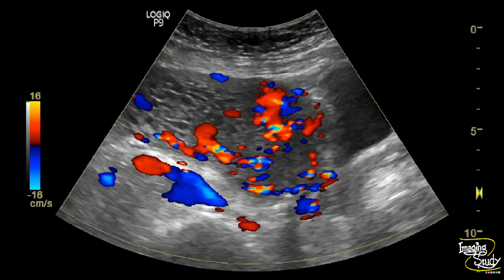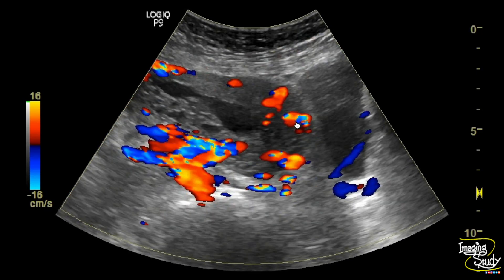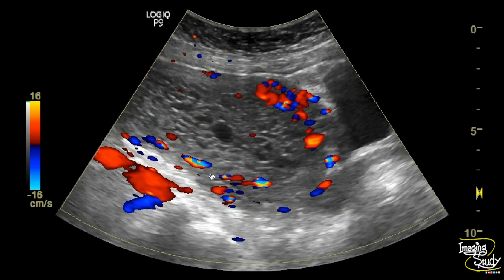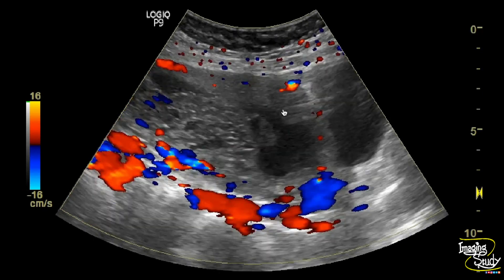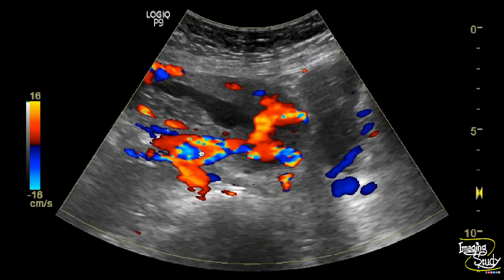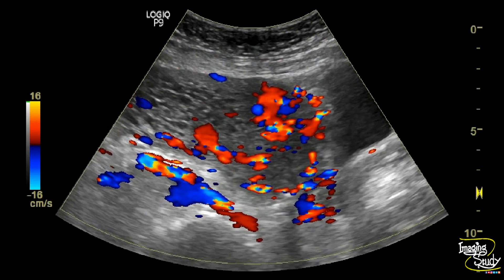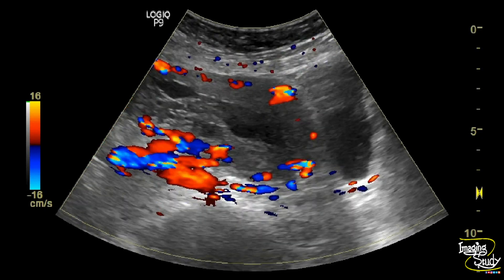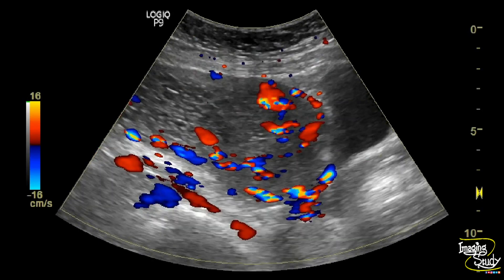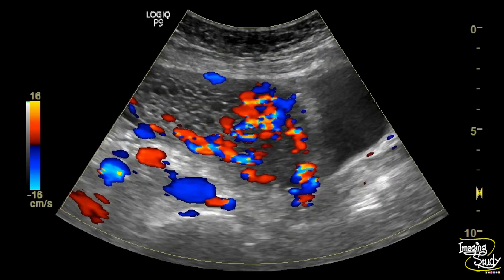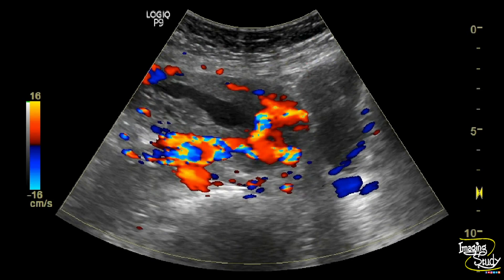Here is the color Doppler picture. You can see some large irregular tornado-shaped lacunar vessels showing turbulent flow at the posterior and anterior aspects. These are bridging vessels extending to the myometrium. These tornado vessels are a feature of adjacent myometrial invasion. This type of tornado vessel or bridging vessel is also seen in placental invasion, as in morbidly adherent placenta.